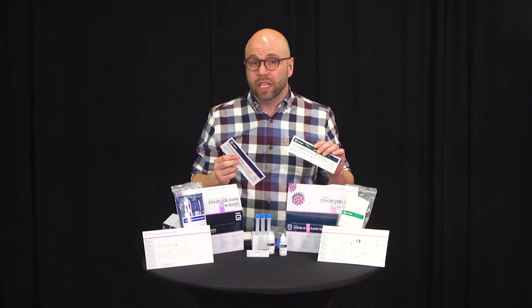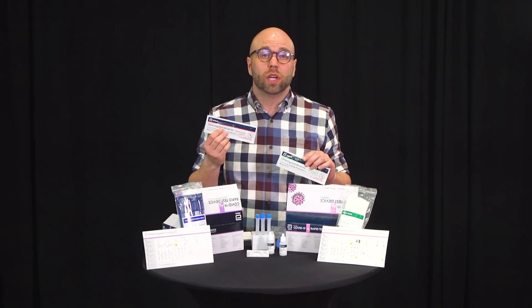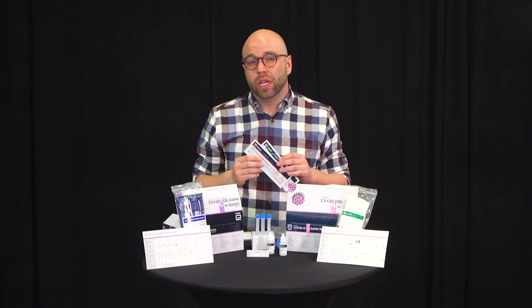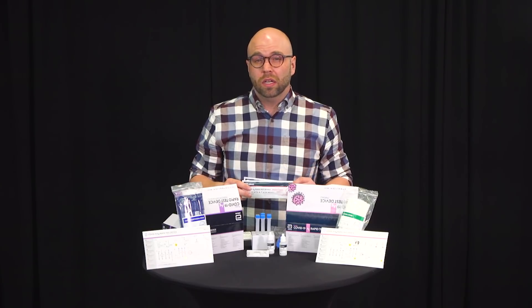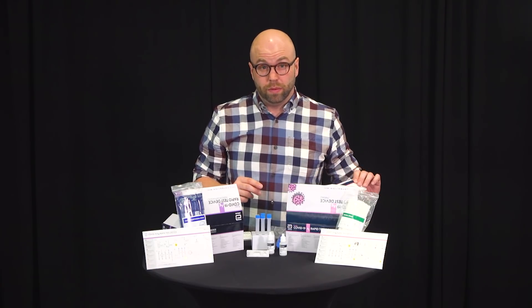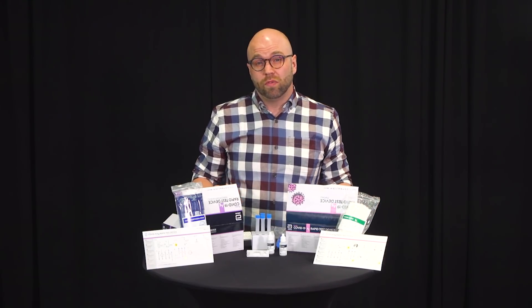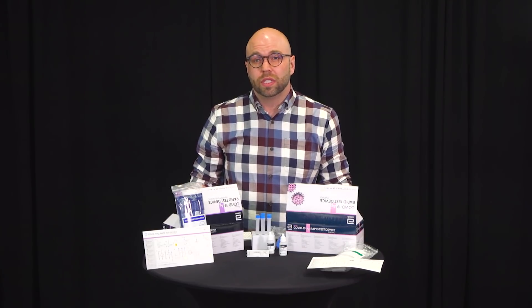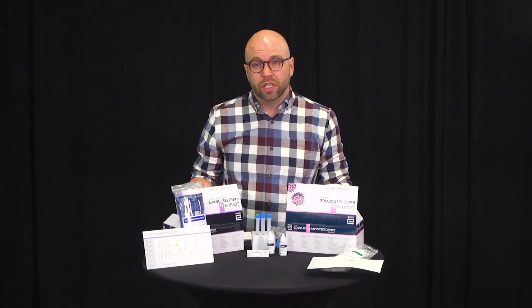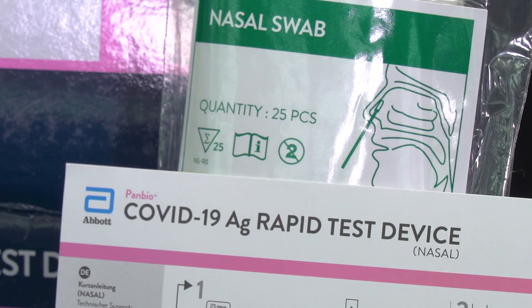One will guarantee a negative result, the other will guarantee a positive result. They're only for quality control purposes and not to be used for any nasal swabbing. Most of the time you'll ignore them. However, if you want to perform a quality control test on the kit, these are the swabs that you will use. You simply enter them into the buffering agent — you do not swab anyone's nasal with them.